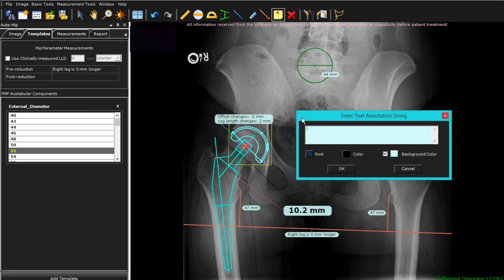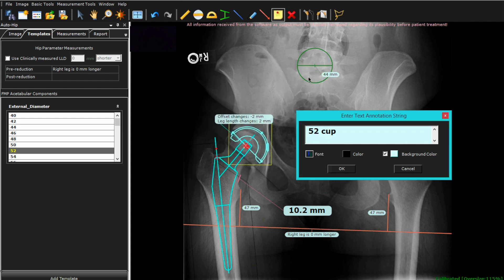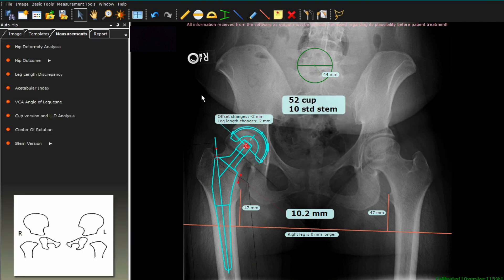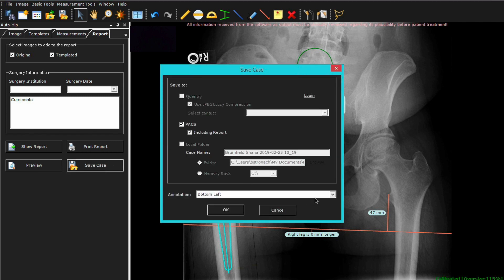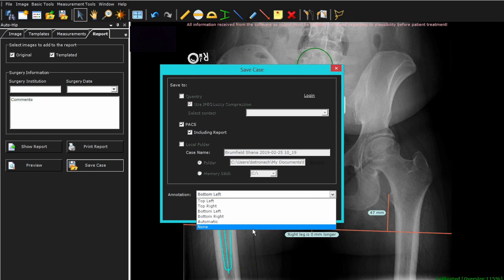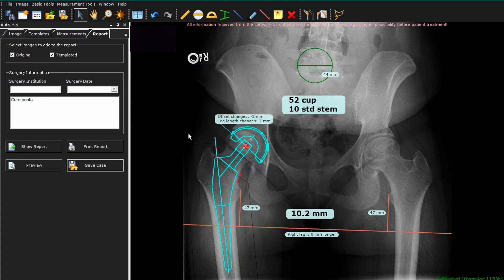I then like to use the note tool to add the basics about the implant so it's directly on the image. So we're going to have a 52 cup and a 10 standard stem. I'm then going to click on the font area again, blow this up to bold and 16 so I can see it. This lets you have a minimal amount of information on the screen and is easier to read than the annotation. Now click on the report tab, which is going to pull up the report to save the case. Since I've done my annotations on the screen already, I'm going to turn those off and go to none, then hit OK — this is going to send the case back over to your PACS system to save it internally in the PACS folder for that patient.